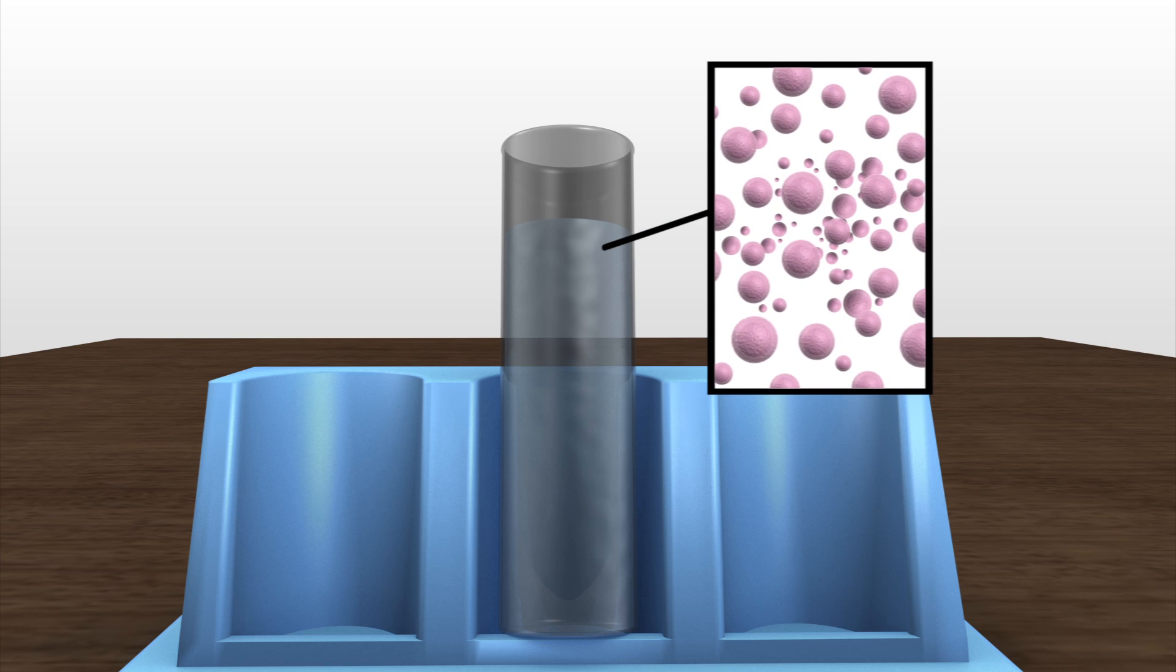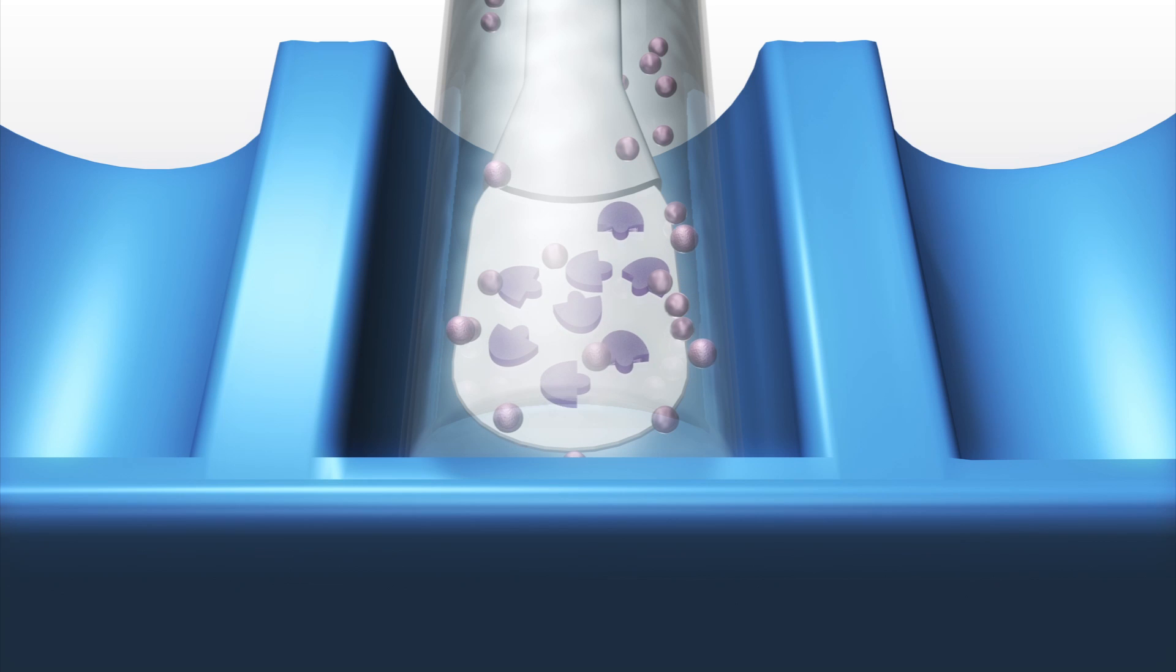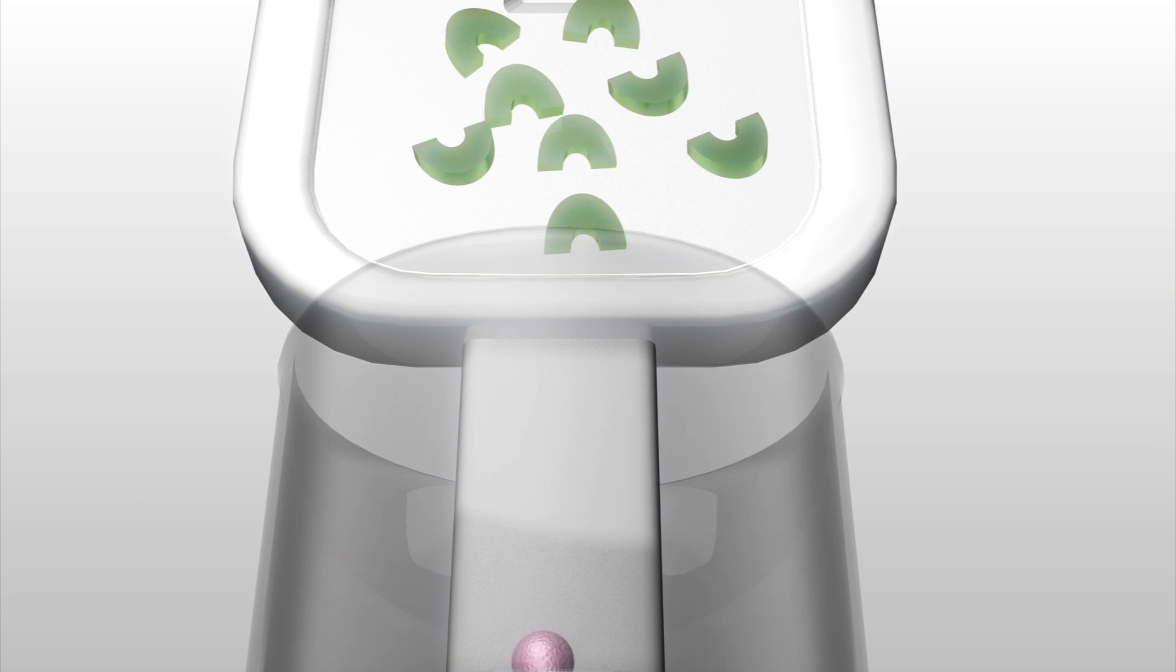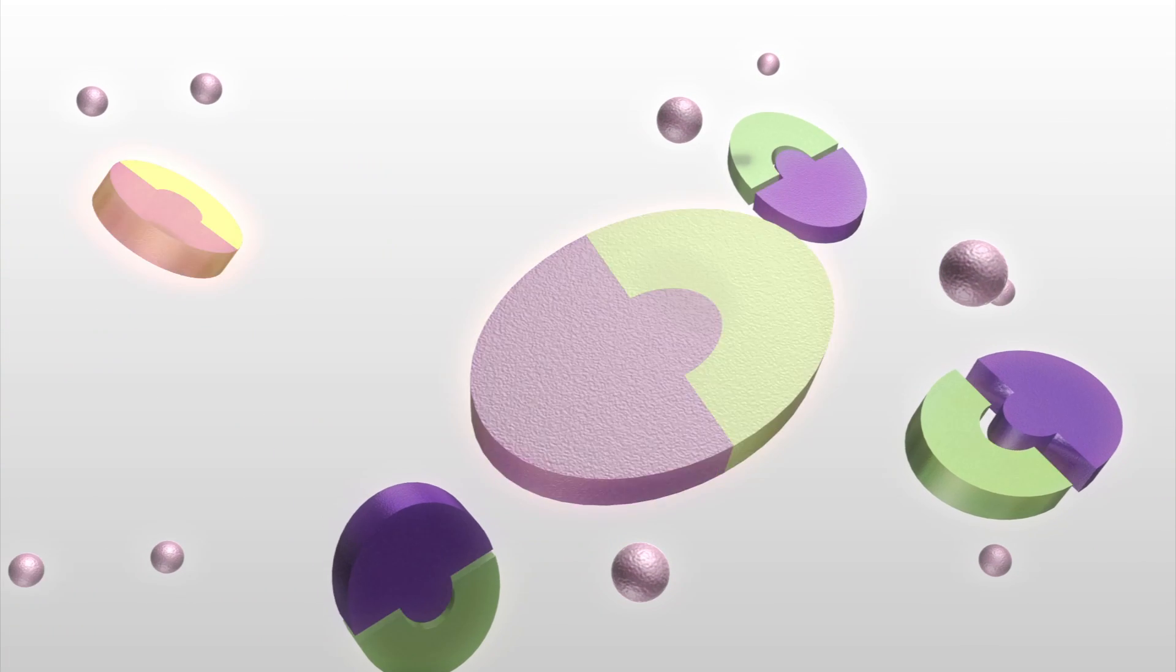The test kit is inserted into an enzyme-containing test fluid. Both the enzyme and HIV antibody from the oral fluid travel upward. The antibody meets the antigen and naturally binds to it, triggering the enzyme to react to the binding.